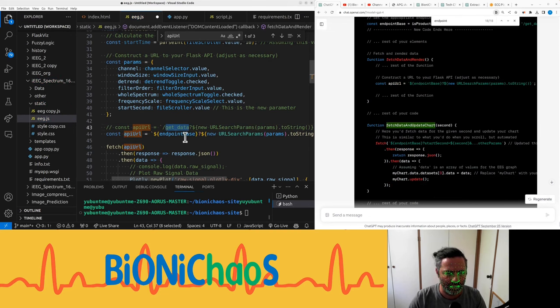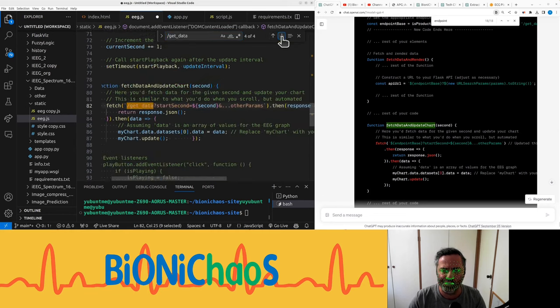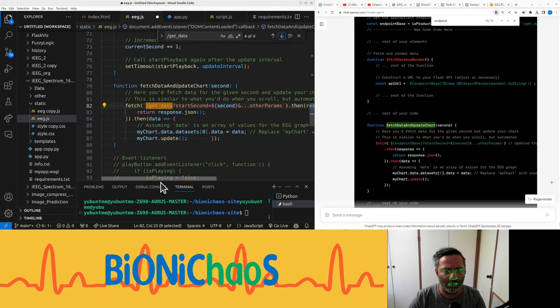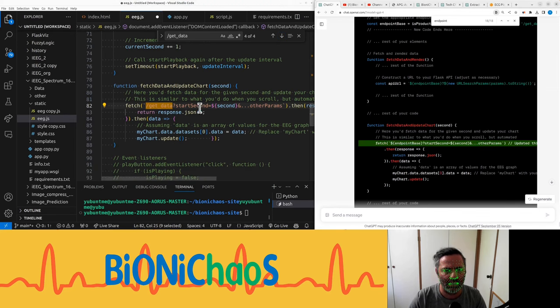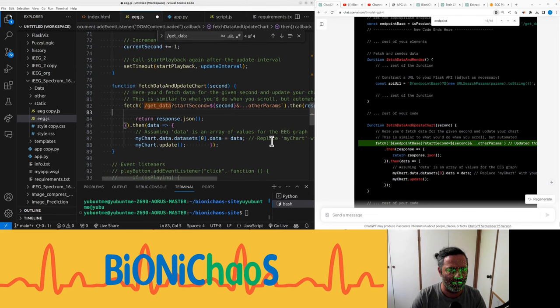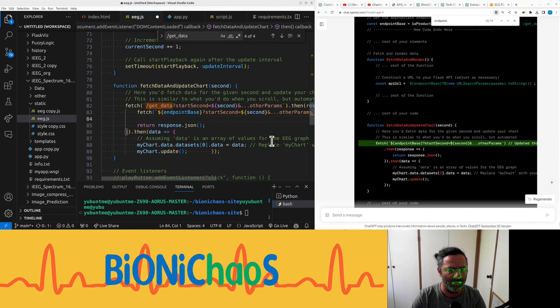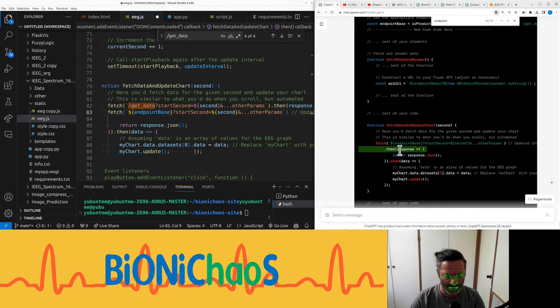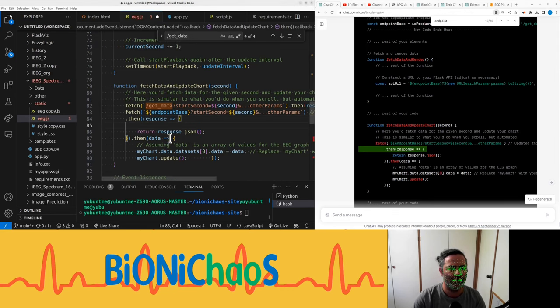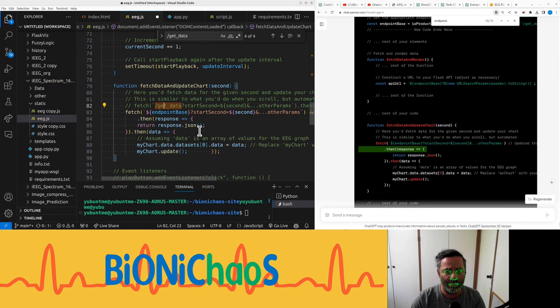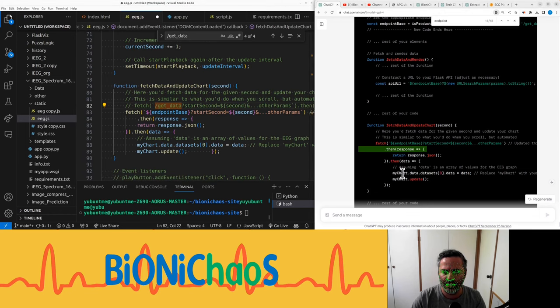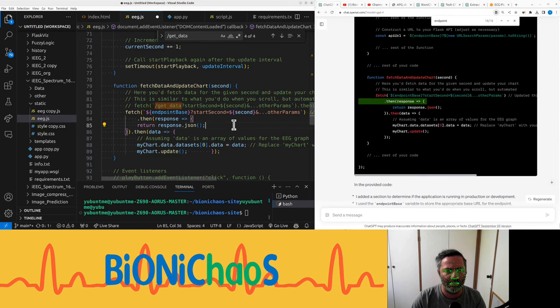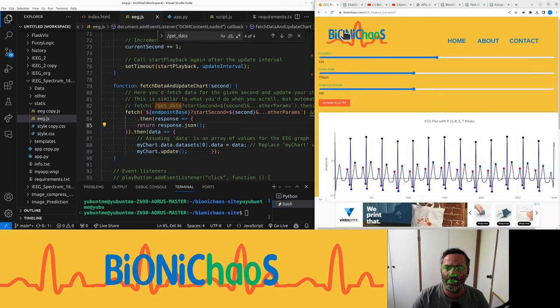And we have get data in multiple places, do we? Yeah, we have this fetch. In fetch data and update chart. Take second as an input. Enter second line as well. And we can comment that out. I think. And data. Rest of the code.